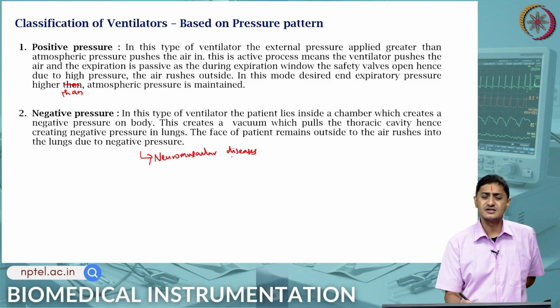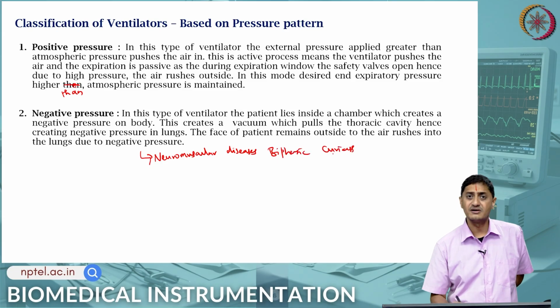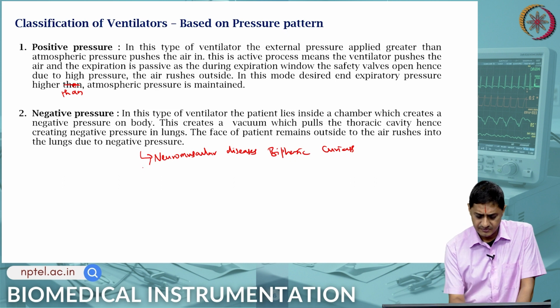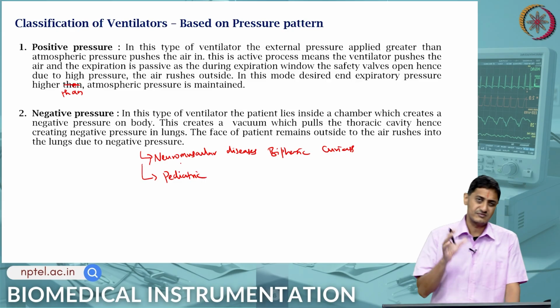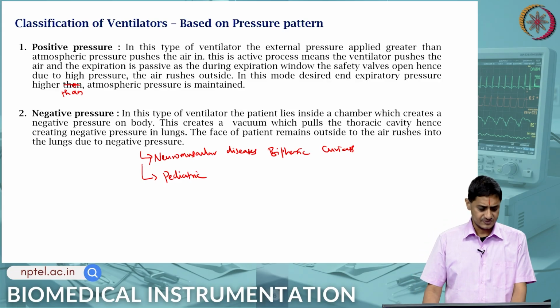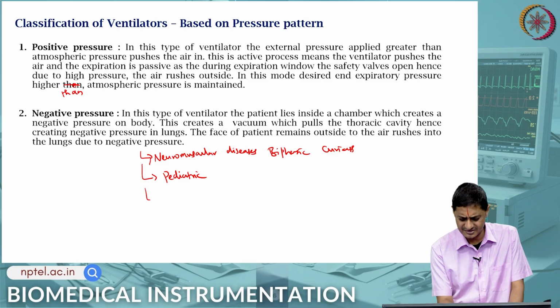These are the cases that require biphasic ventilators, right. And cases in which the patient might be a pediatric neonate, where you want a non-invasive technique, otherwise you have to put the tube. The baby is very small, a non-invasive case. Pediatric case. Another might be research, for example, space medicine, microgravity.